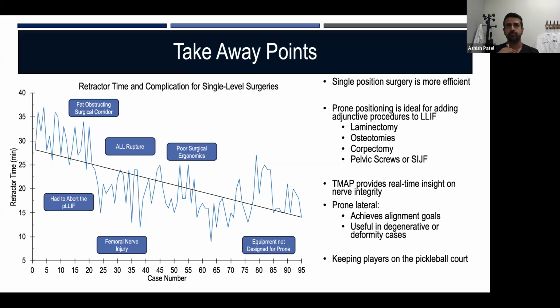And so, one, I've avoided having further ALL ruptures. But what you realize is that when you do have an ALL rupture and the implant looks that far anterior, you've got to restart what you do. There's a reason why it's getting pushed out anteriorly. One, it doesn't have that barrier anymore.